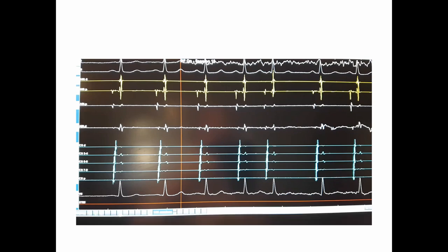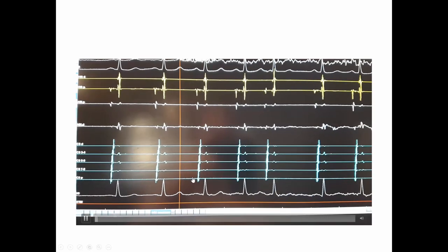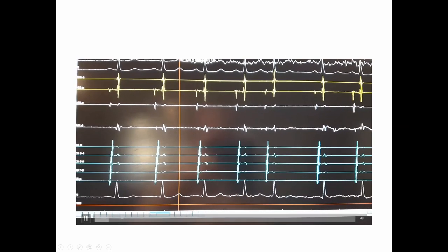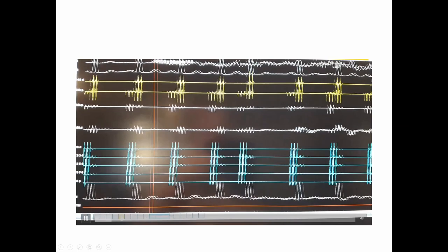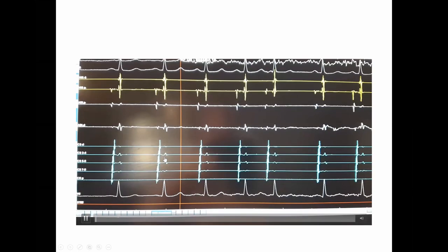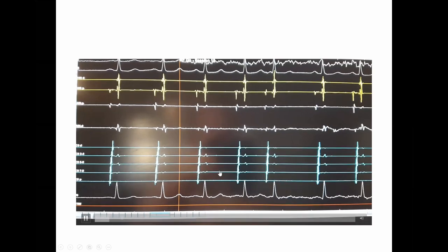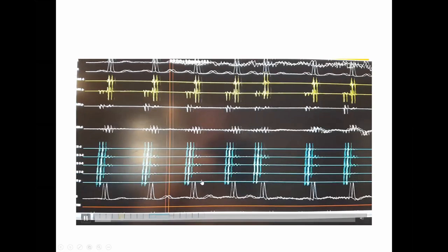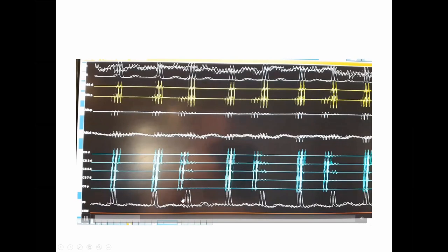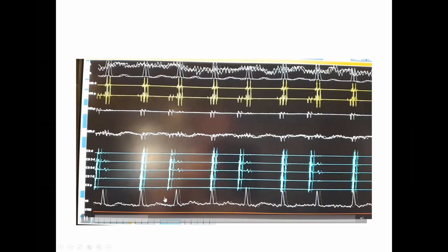And this is now playing in real time. And so I'll stop it in 2 seconds. Just stop the thing altogether. So I'll just call out the J's when they happen. So there's a J there, J, J, J, J, sinus J, J, J, sinus J, J.